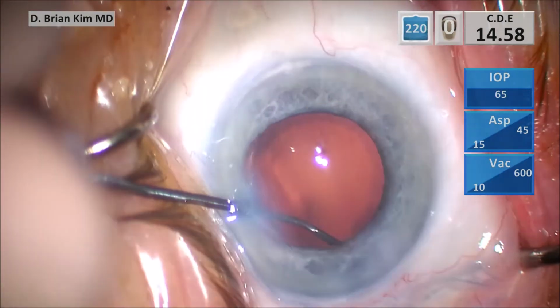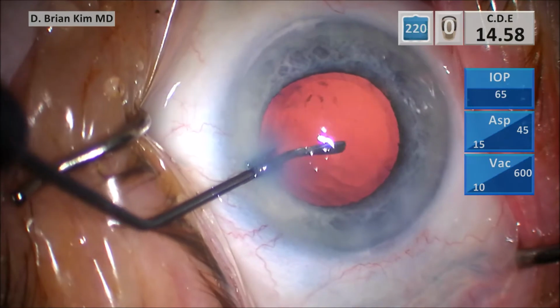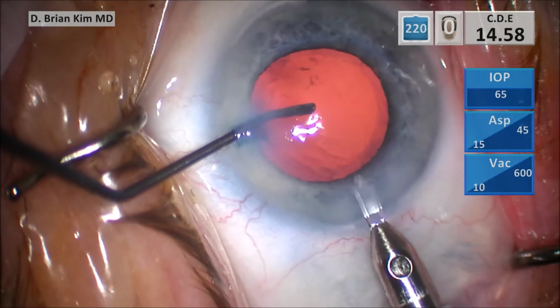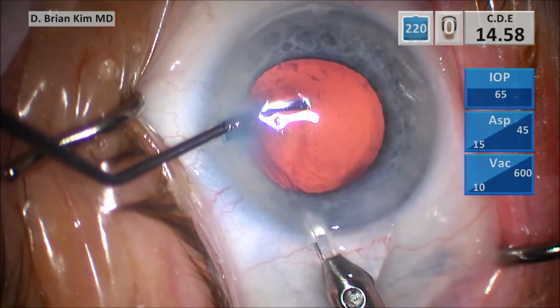And remember, with these super dense lenses, I always like to put in a 3-piece lens because I do think there's a high risk for zonulopathy. And long term, if there's a problem, I want to be able to use that 3-piece lens if possible to reposition the lens if it's trying to dislocate.